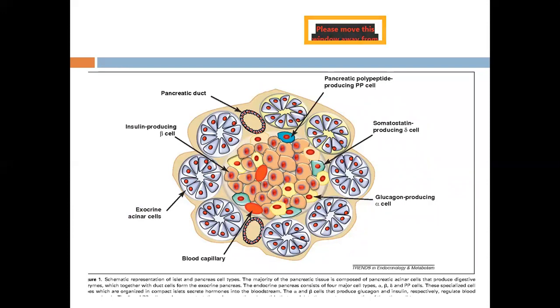This covers the exocrine part of the pancreas. Now we come to the endocrine part. Endocrine pancreas is composed of spherical aggregations of cells. These spherical aggregations of cells are known as islets of Langerhans.